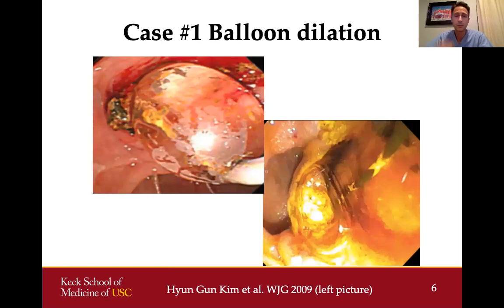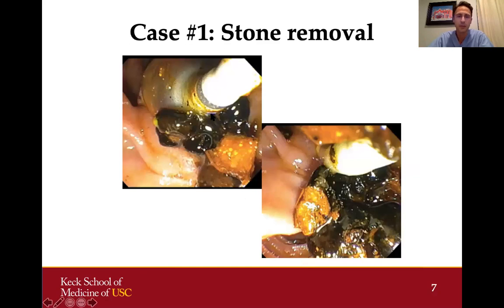The next thing I did to make stone removal easier was to dilate the papilla to 15 millimeters to really open it up. You can see in the picture on the right from my patient that we've opened up the papilla to an extent where smaller stone fragments were actually spontaneously passing on their own. Some smaller fragments were removed with a balloon catheter, and the larger stone came out quite easily after that dilation.